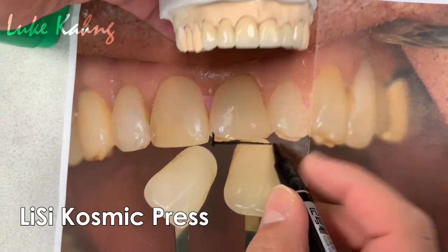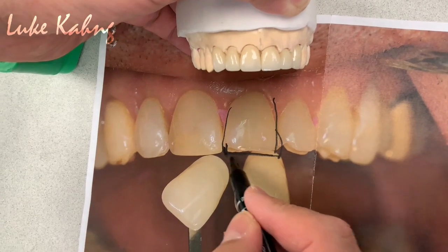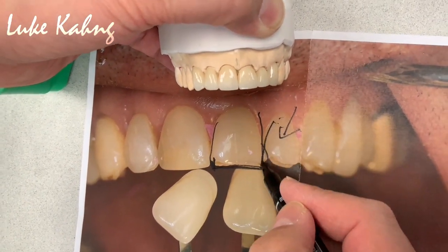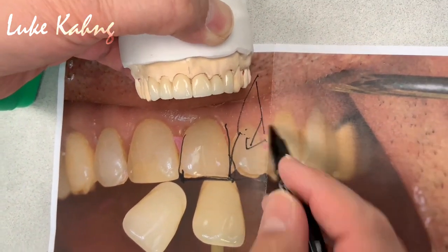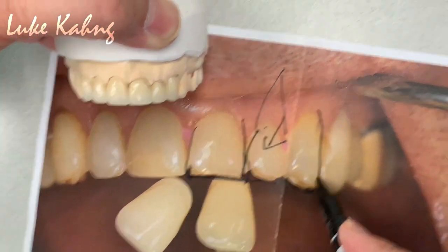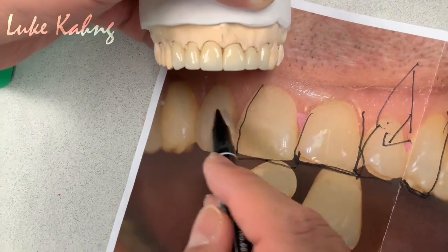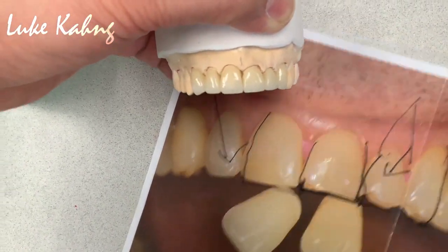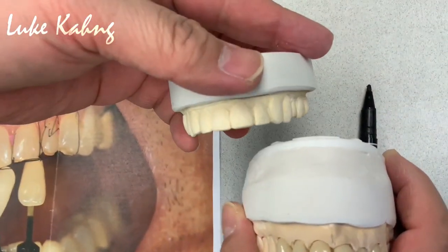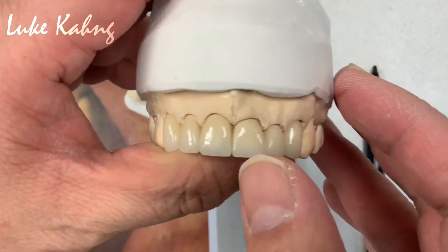So we redesigned from the practice and then bringing in here to make more lifelike because too long axis. Canine shape is not bad, so we add it slightly, very slightly. Lateral, we compensate central between those moves here, same thing. So here's what we finished compared to what Dr. sent me, the temporization. We make the long axis better for the more visual.